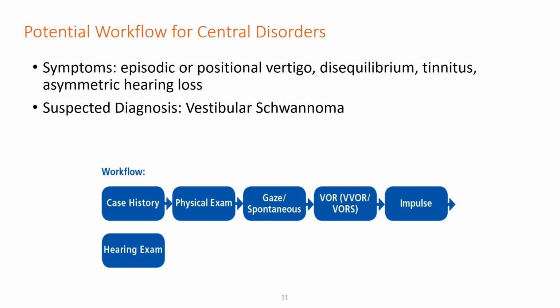So again, always include a hearing exam, but especially in this case where someone says the hearing seems to be different in one ear than the other. As an audiologist, it's always my gut feeling to say, let's test your hearing. But especially if you are outside of the audiology field and you're listening to this, because these two mechanisms are so closely involved, it's always a good idea to make sure their hearing is intact as well. It can help you support a central pattern, or it might give you a heads up that this patient does have hearing loss, and maybe that impacts how you interact with them coming in the future.